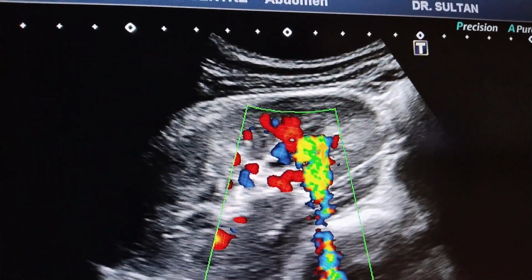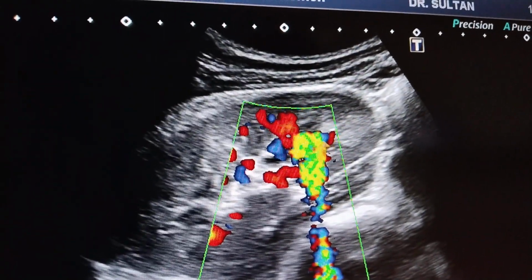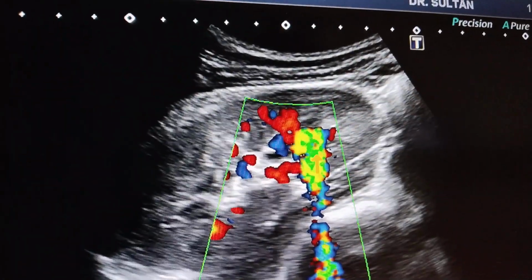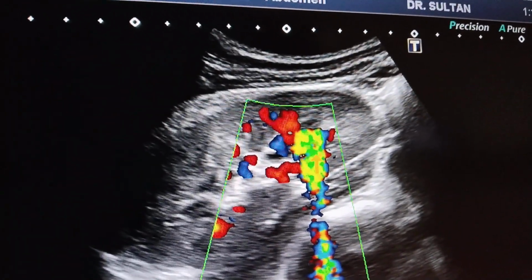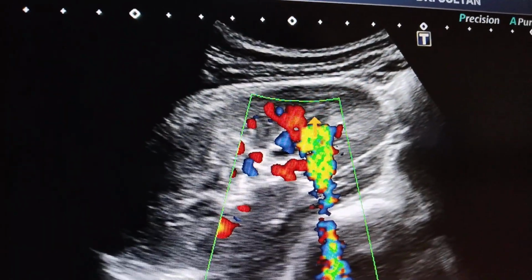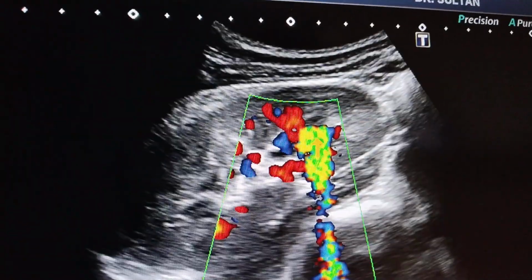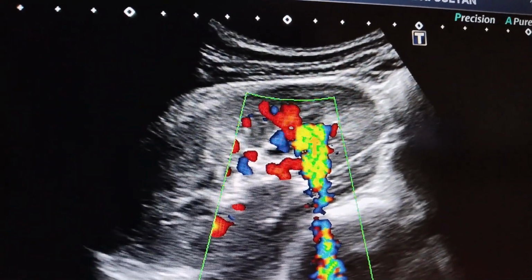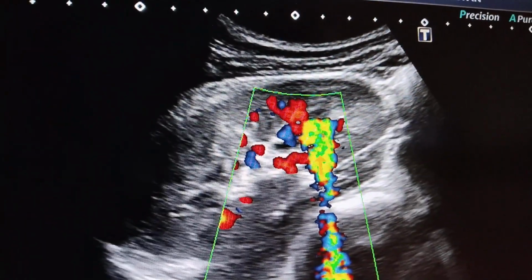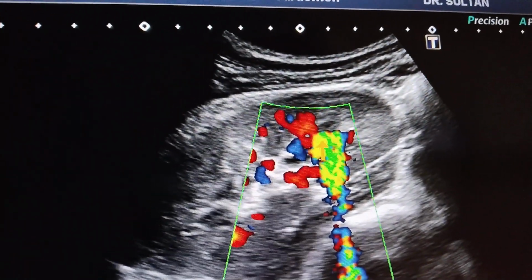The Doppler machine generates such rapidly changing colors when it strikes a highly reflective surface that is irregular and rough. So this produces such rapidly changing colors which we call twinkle artifact.